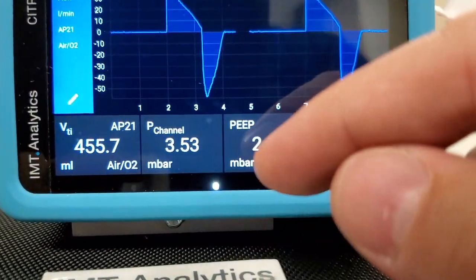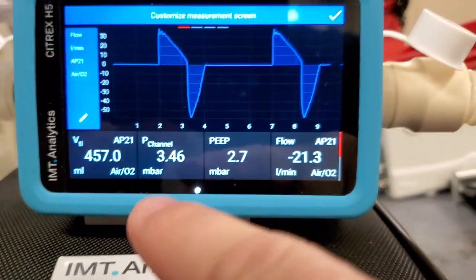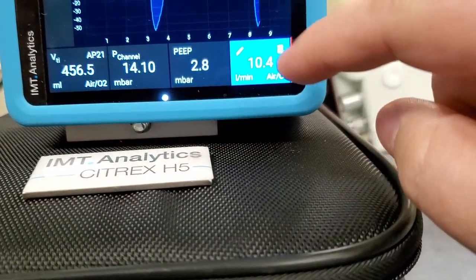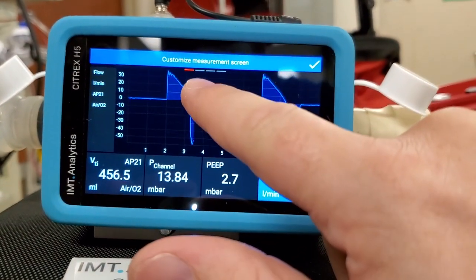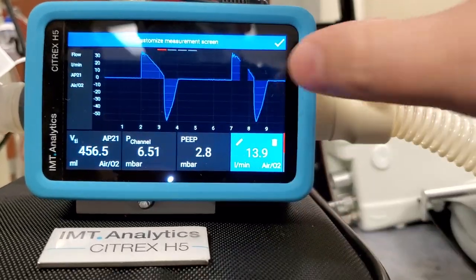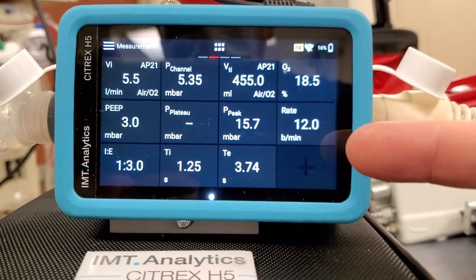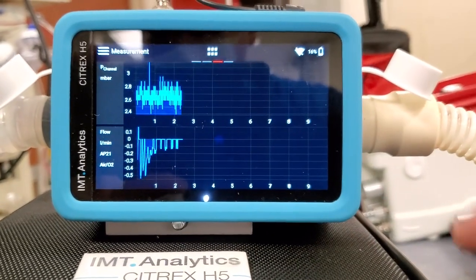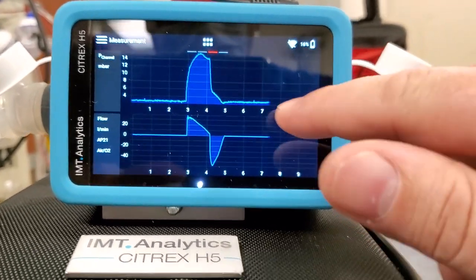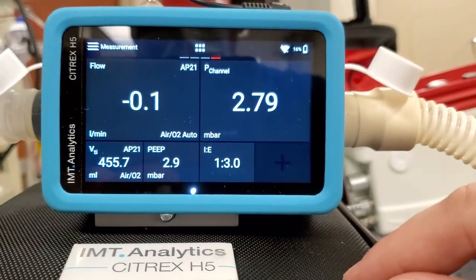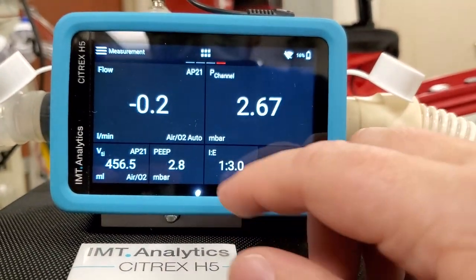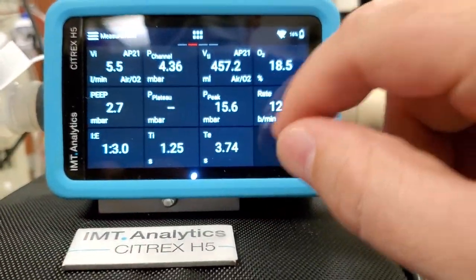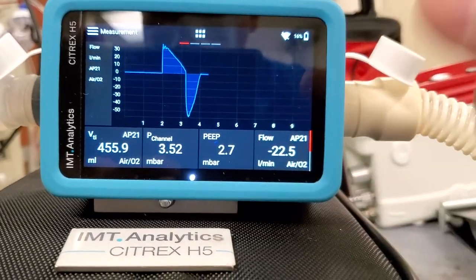Everything on here is customizable. If you want more than four numerics, you swipe down — you can add four more numerics on the primary screen. And there are additional screen tabs: one, two, three, four different screens. Swipe to the side and you get all numerics, all editable and moveable. Swipe again and you get pressure waves in detail. Swipe again and you get flow, pressure, tidal volume, PEEP, inspiration and expiration rate all in one screen. Really dig that — and this is from the default screen.